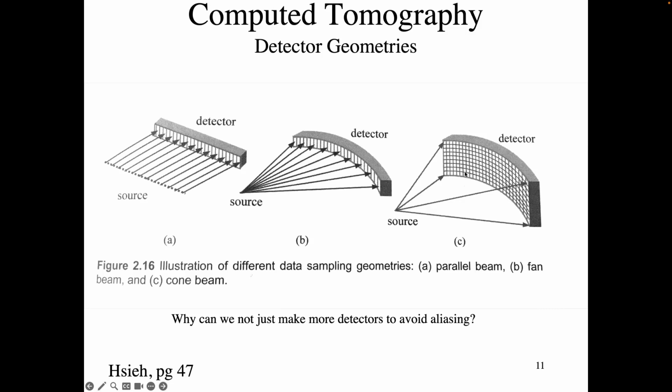And in 3D, exactly the same. You stack these on top of each other. And then your object is in here in 3D, and casts this 2D shadow on your detector array, right? So basically our fundamental frequency of sampling the shadow is set by the distance between these detector elements, right?